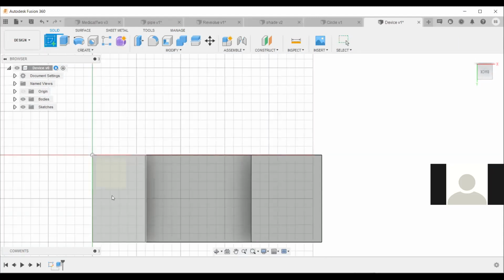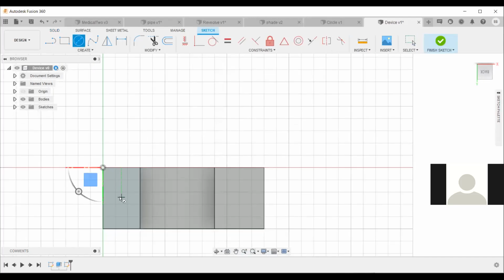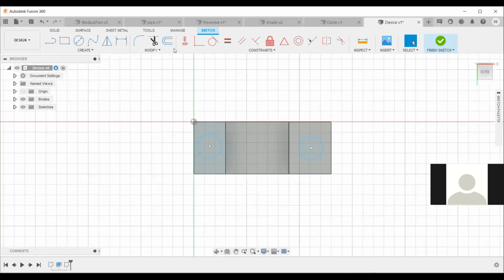So you can create a new sketch here. You draw a circle. Hapo. Then you want to draw it on the other side, but of the same radius. So how are you going to do that? You are going to label one. You can decide to label both of them, but okay, now you know. So you do 20. Hivyo. Then I showed you can use equal. So unasema hii and this are equal. So all of them are going to be equal.